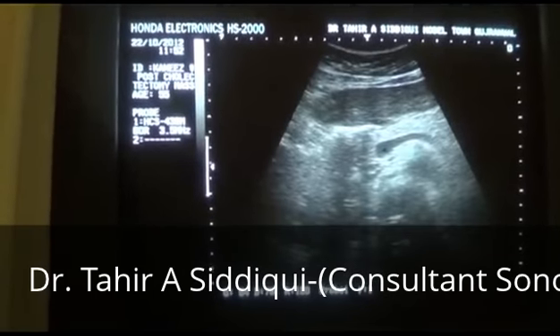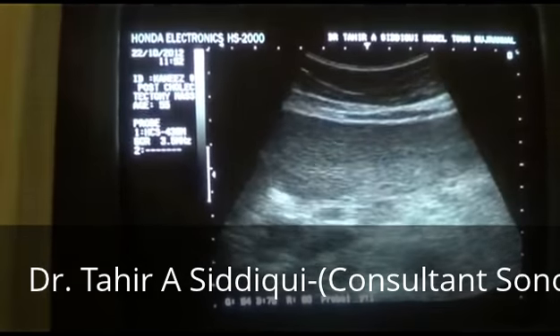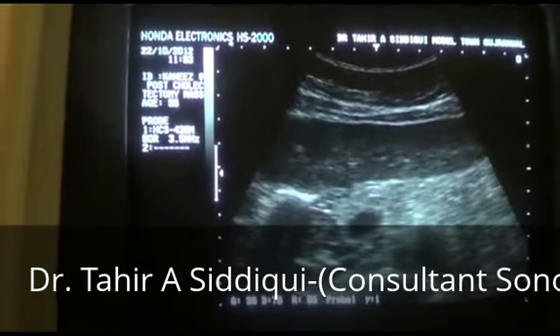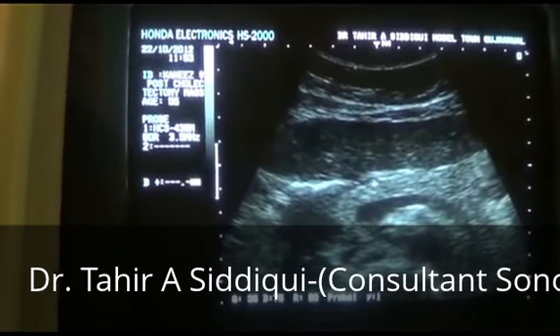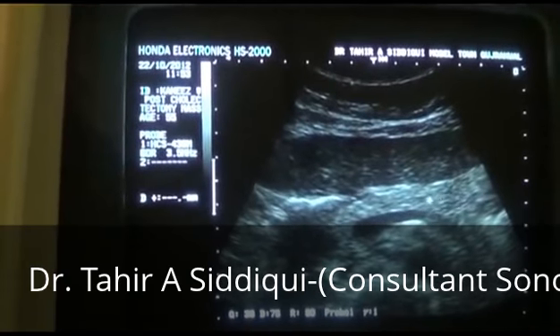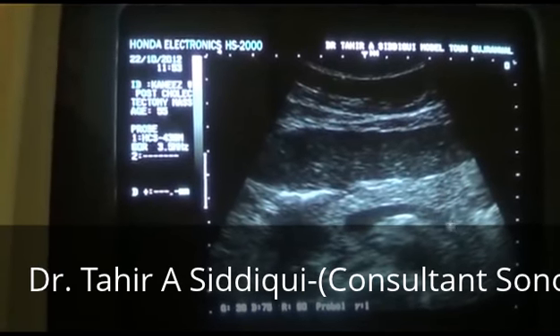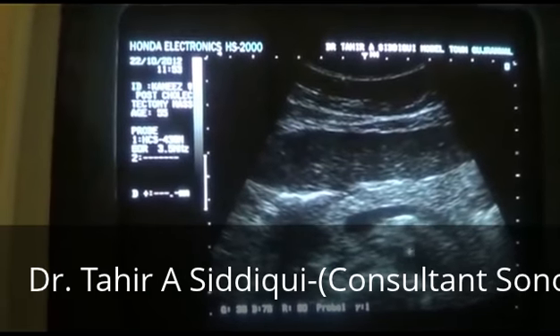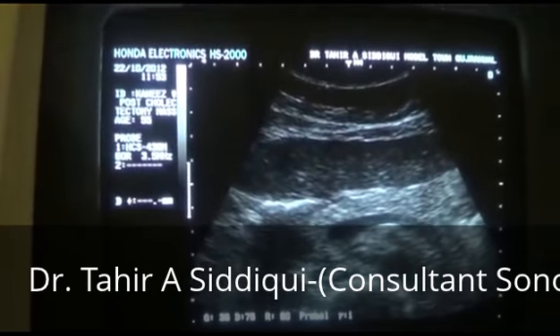Now let's see the pancreas. Here we see the pancreas. In transverse section, this is the splenic vein, superior mesenteric vein, aorta, and superior mesenteric artery.